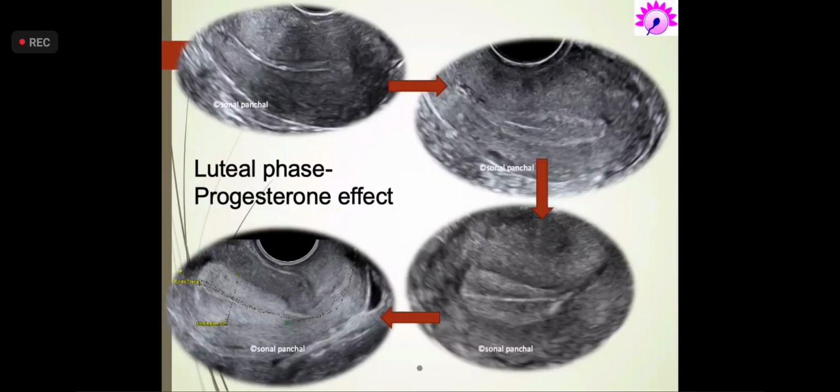If you see that the endometrium has started becoming fluffy before your trigger in a down-regulated cycle, it indicates a possibility of a rise in progesterone. But if the outer margin of the endometrium starts becoming hyperechoic, it is definitely a pathological rise in progesterone and will affect the endometrial receptivity. Fluffiness occurs in the first 24 hours after progesterone exposure, so within about 10-12 hours of rupture. Hyperechogenicity occurs after 24 hours of progesterone exposure, and the levels are usually higher than 1.5 nanogram.